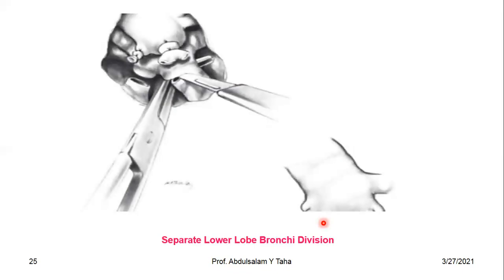And this is the technique of separate lower lobe bronchi division. As we said, the lower lobe has a superior segmental bronchus and basal segmental bronchi. We can divide them separately or in one session.